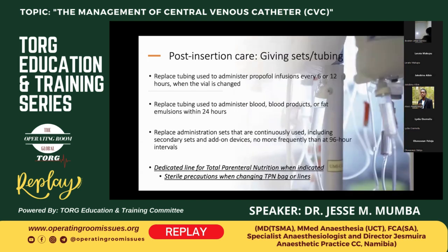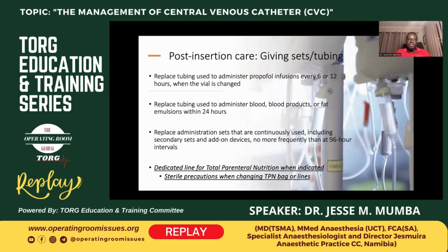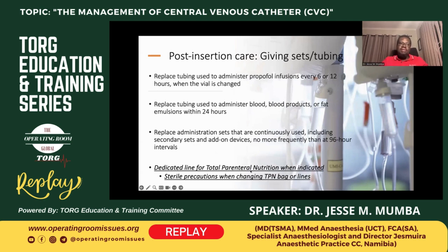And then I've talked about this a bit in terms of when do we change the tubing. And I think for this slide, the most important is to have a dedicated line for total parenteral nutrition. And when indicated, you use full sterile precautions when changing the line or the TPN bag.